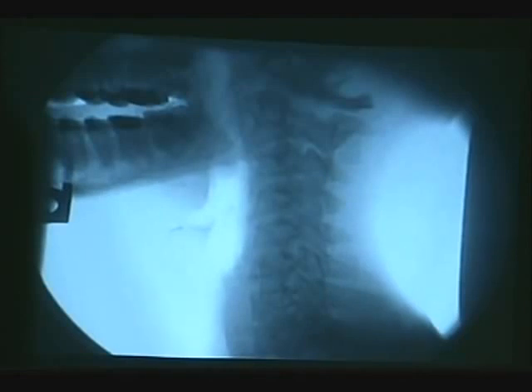Why would the fractures show up on a flexion view? Because I am taking 30 digital x-rays every second. Could it have shown up on one or two x-rays? Possibly. But I took about 2,700 x-rays in a series and was able to pick it up — only at certain angles, at the oblique. The answer is you could find it if you knew which of the 2,700 views to push the button for. We're not that good with static x-rays. That's why this technology is so superior. In court three weeks ago they asked, how come you always find the injury and our doctors don't? I said, it's technology. How many x-rays did your doctor take? Five. I took 2,700. Juries understand that.